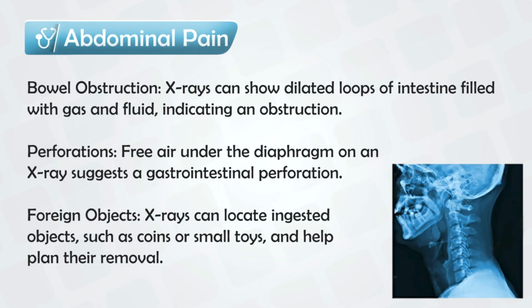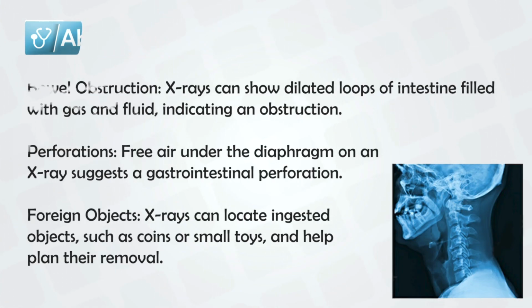In cases of severe abdominal pain, especially with high lactate, and if the patient is constantly vomiting, they might have some abdominal conditions like bowel obstruction or bowel perforation. X-ray can be used and you will see multiple air fluid levels, which indicates bowel obstruction, or you can see air in the abdomen or air underneath the diaphragm, which indicates bowel perforation. And these are serious emergency conditions that require emergency surgery. It can also be used to detect ingestion of small metallic bodies.